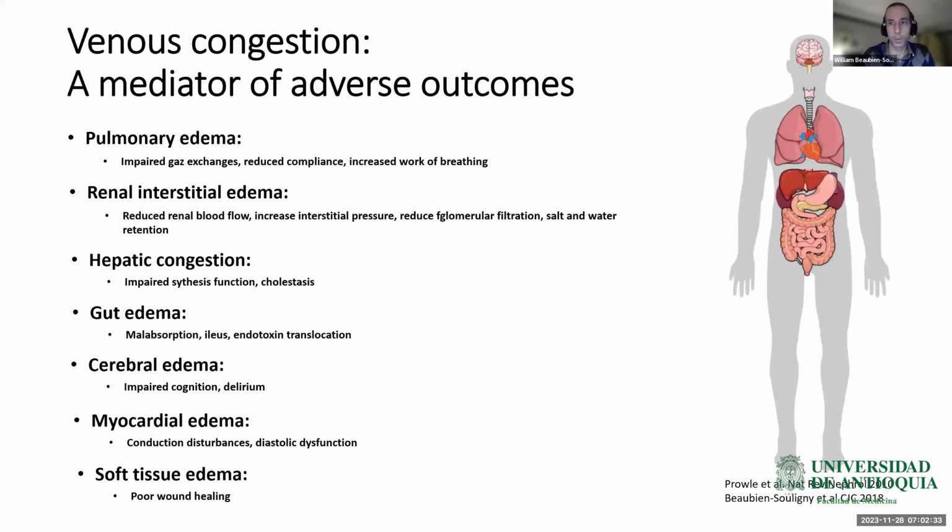So if you go in the portal vein or the intrarenal vein, you will see a continuous flow without much pulsatility during the cardiac cycle. If you go closer to the heart, in the hepatic veins, then you will see the triphasic waveform that is compatible with the CVP, the variation in pressure in the right atrium.